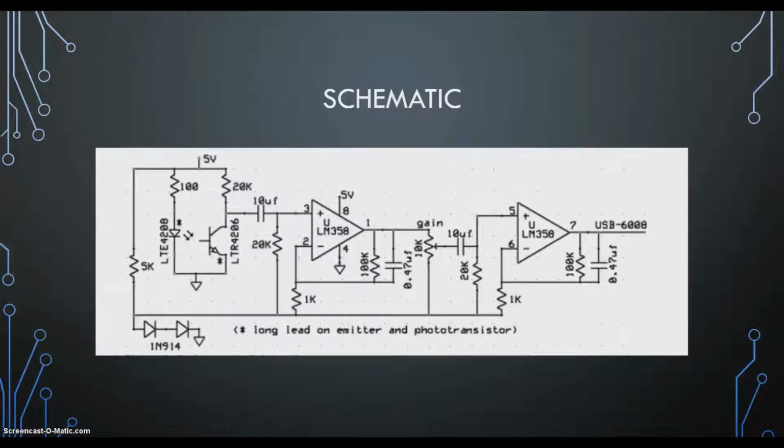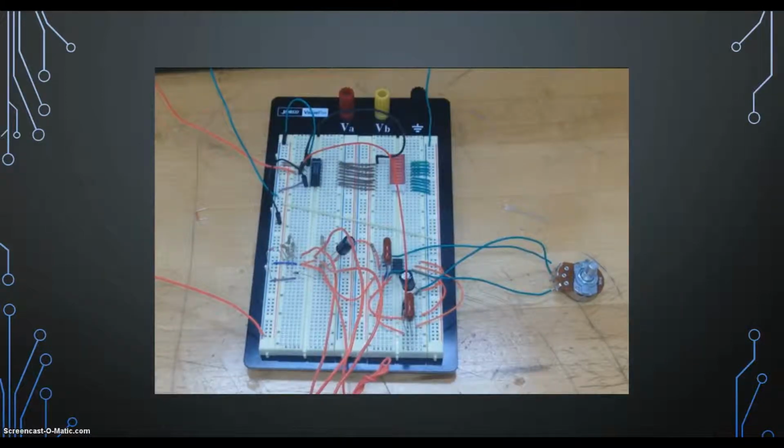Here we see the schematic design for a finger pulse instrument. We use different types of components from a phototransistor to an infrared LED, op-amps, diodes, capacitors, and resistors. This picture demonstrates the transformation from a schematic to the actual breadboard, including the schematic from the LED bar.